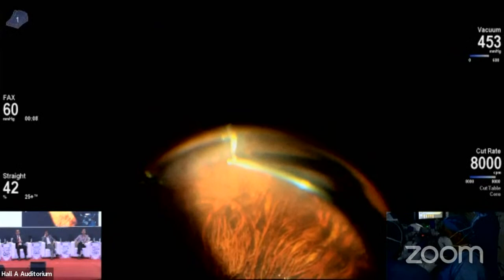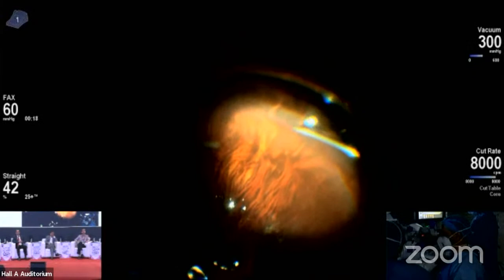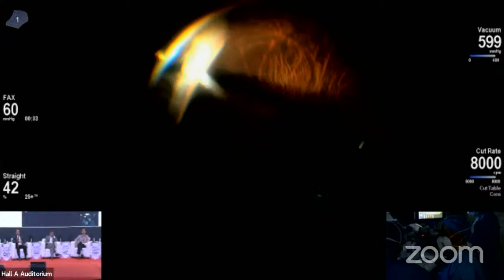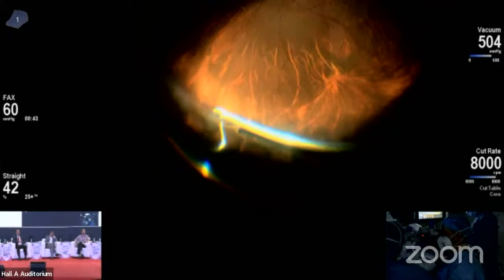You know, with the instrumentation and visualization system, things have become much better. Earlier, when the visualization system was not better, we never used to reach that area. Or if sometimes we had to go, we had to use depression. We used to depress and then do the vitreous shave. So technology has improved a lot of comfort. So you can see we are doing vitrectomy right at the ora, and whatever little vitreous is there, we are removing that.